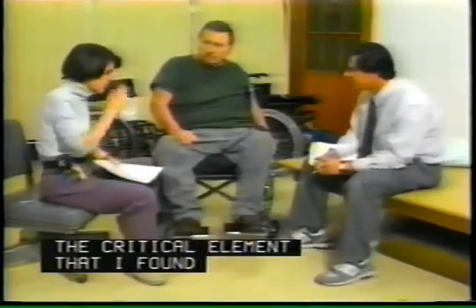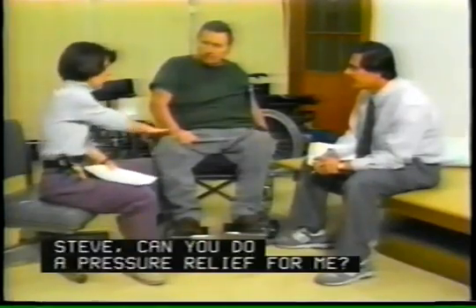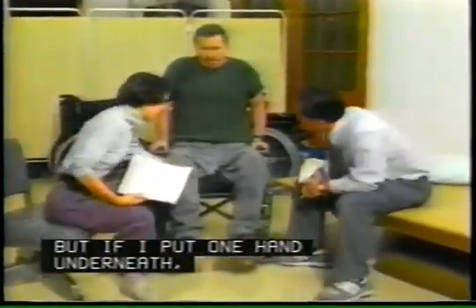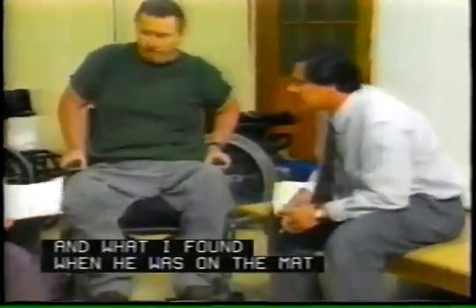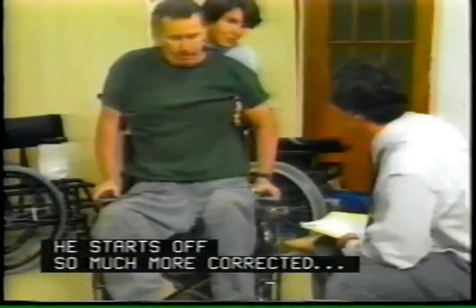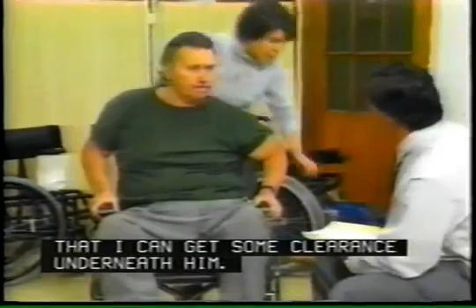Okay. The critical element that I found in talking to Steve and watching him is, Steve, can you do a pressure relief for me? That he is so flexible here, but if I put my hand underneath, he's really not relieving the pressure underneath his buttocks. And then come back down. And what I found when he was on the mat is I can get some correction, and if I hold him, now do a lift up, he starts off so much more corrected and come back down that I can get some clearance underneath him.